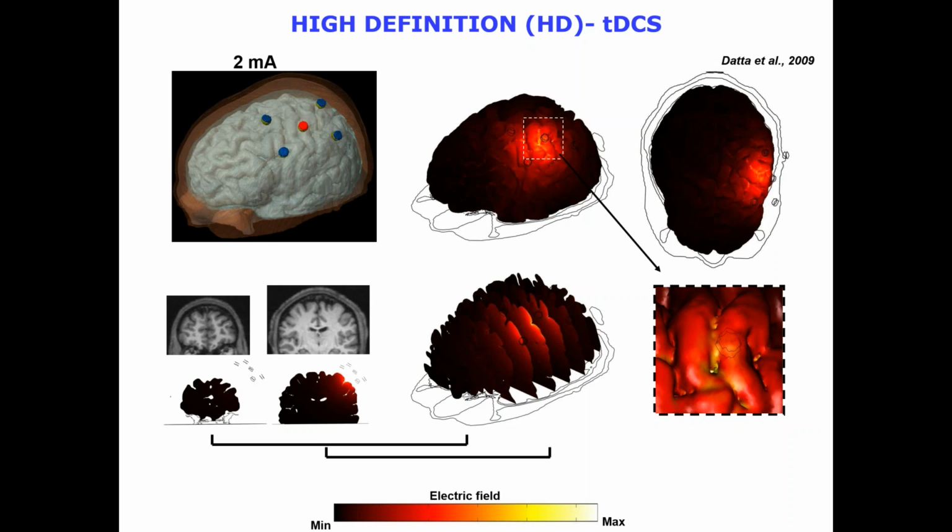that we're looking at. But more commonly, after their 3 rounds, what we typically do is what's called a washout. So we let the gains, whatever the changes were in the brain, whatever the functional changes we were able to garner from functional reevaluation, wash out over 4, 5, 6 weeks.